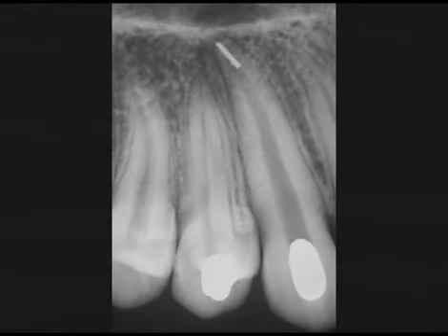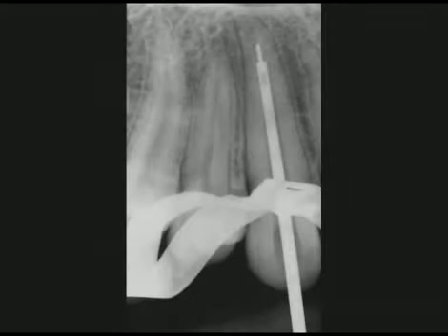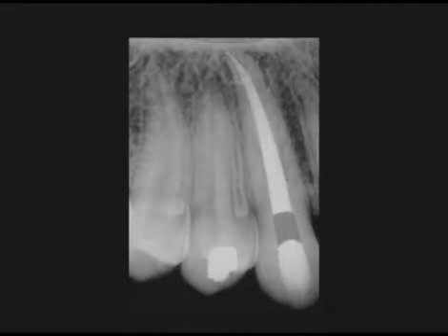Here's the preoperative radiograph of a temporized maxillary canine and an instrument broken deep in the apical 1/3. A working film shows that the IRS has successfully engaged and partially elevated the deeply positioned file segment. And the postoperative film reminds us of the necessary retreatment steps. Note the densely packed system and the 3 apical portals of exit.